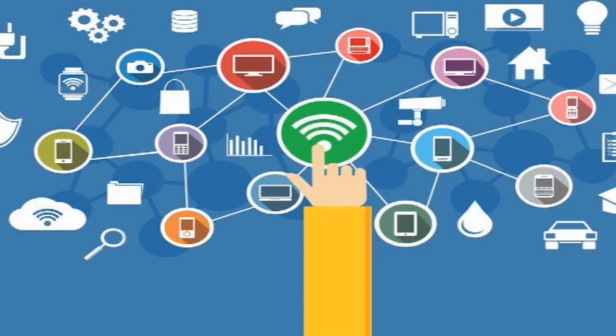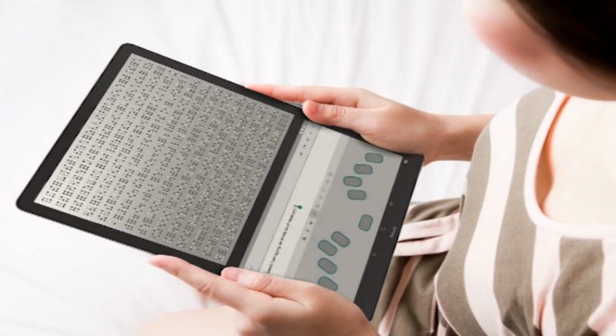The Braille embossers and software help the students to store and retrieve information from libraries and around the world through the internet. Apart from that, the visually impaired can use electronic Braille devices for taking notes, studying for exams, doing research, and a variety of other academic purposes.